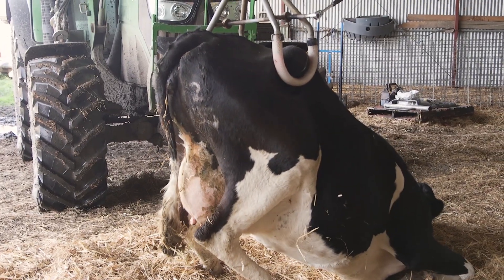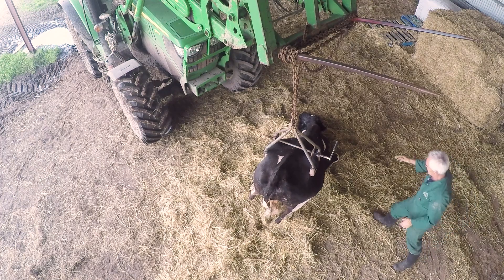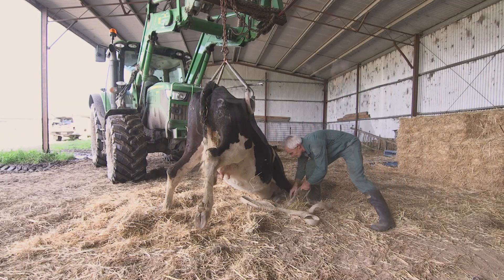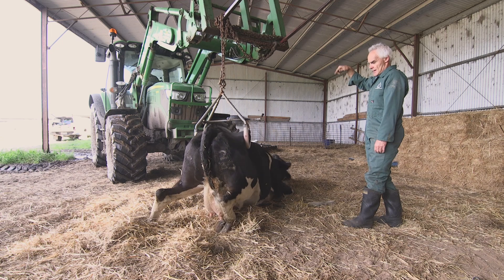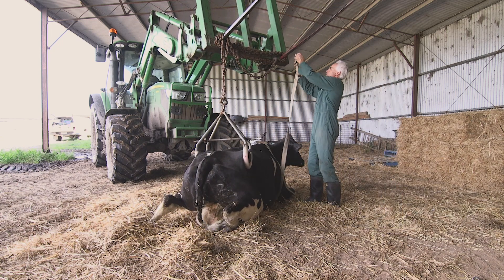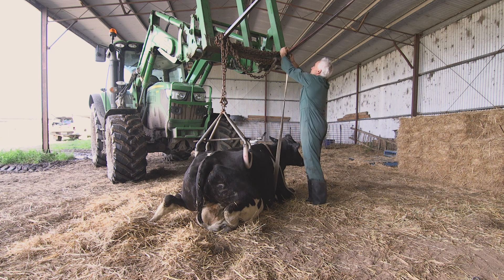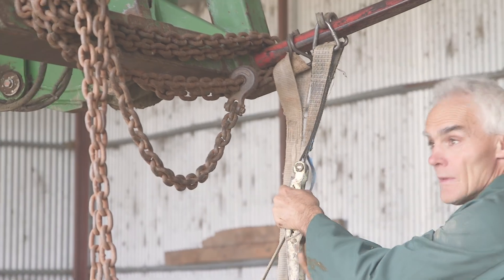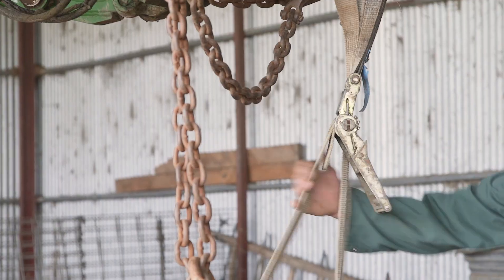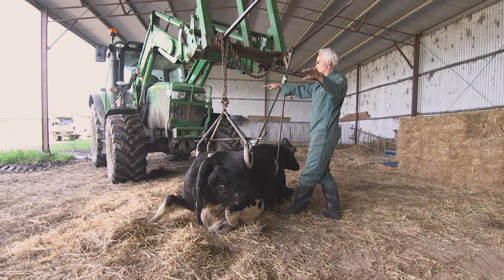At this point many cows will stand, taking full weight on their front legs, unlike this one. With encouragement she may, but if not we need to apply a chest strap. It's important when encouraging the cow to take weight on her front end not to lift them high in the air by the back end, as this may damage the cow. Make sure the chest strap is the correct length so that when she's lifted her back is kept horizontal.